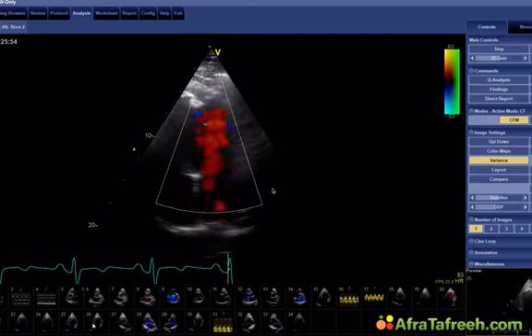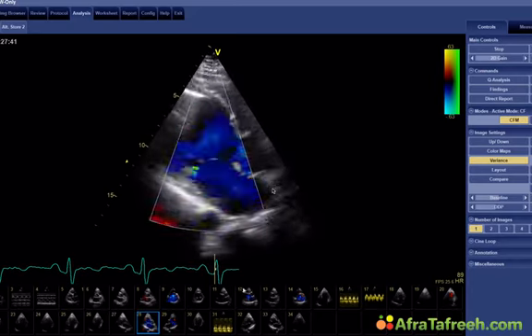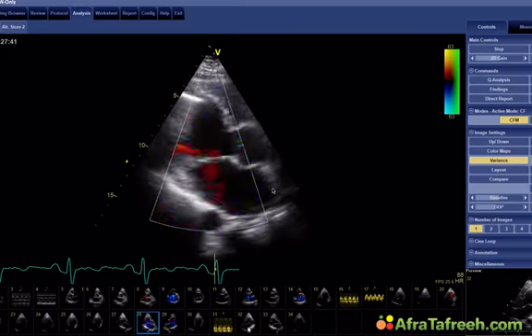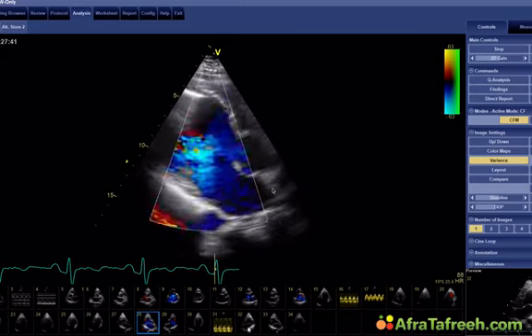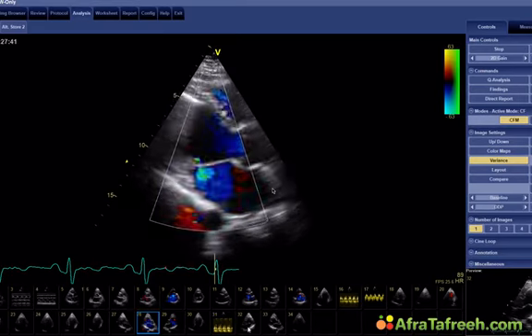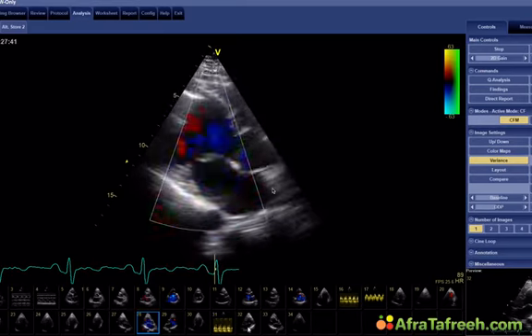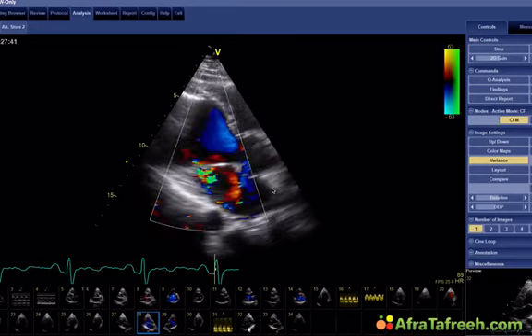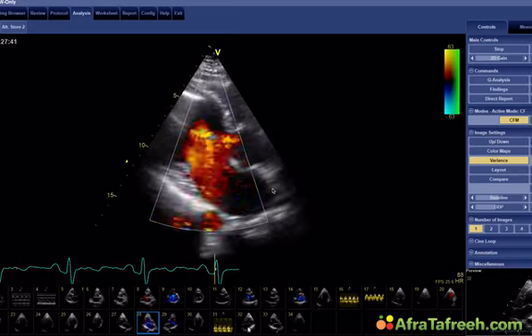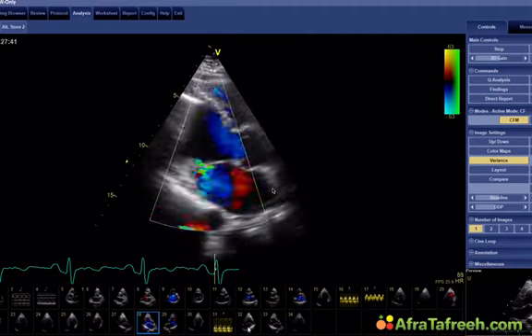From here, the MR looks a bit more, but still much less than it was initially. Here you can see the mitral regurgitation now. The question now is why all of a sudden is mitral regurgitation less? Well, I think, and this is my personal belief, that it is related to the drop in the eosinophilic cells, that the Gleevec he was taking was actually helping him and was actually treating the mitral valve pathology as well.